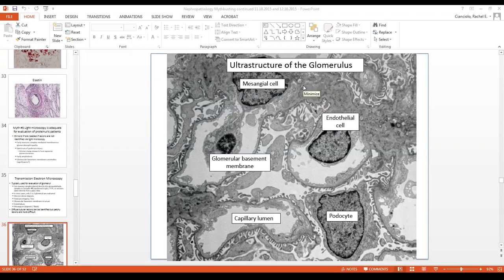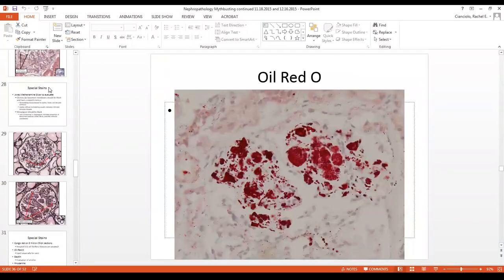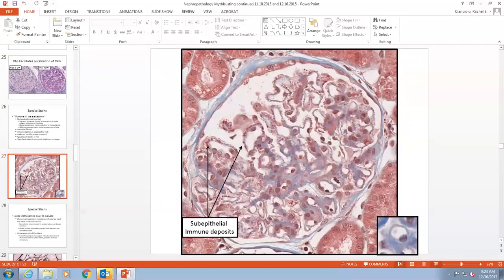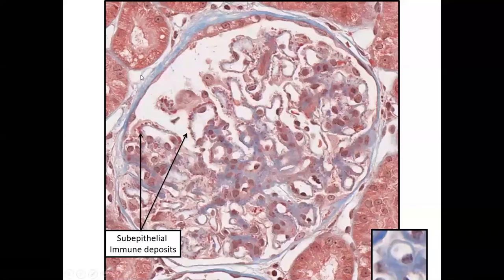Is everything okay? Last question I had was going to be on the trichrome. You've sometimes exercised caution about saying fibrosis with trichrome in certain cases. Could you clarify that? Yeah, so fibrosis of the interstitium, is that your question? Yes. Okay, so sometimes what happens is if you have acute tubular epithelial injury, you have a lot of interstitial edema, and so what happens is your tubules move away from each other.